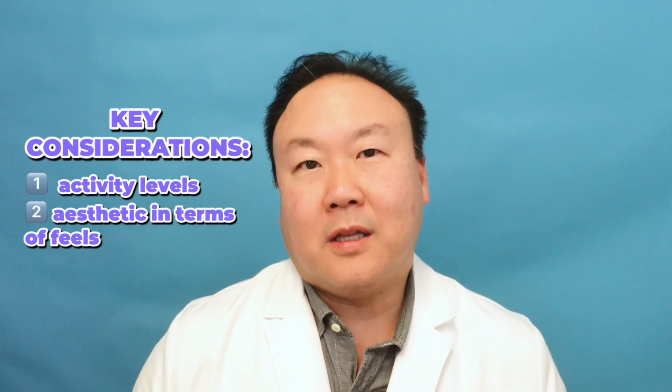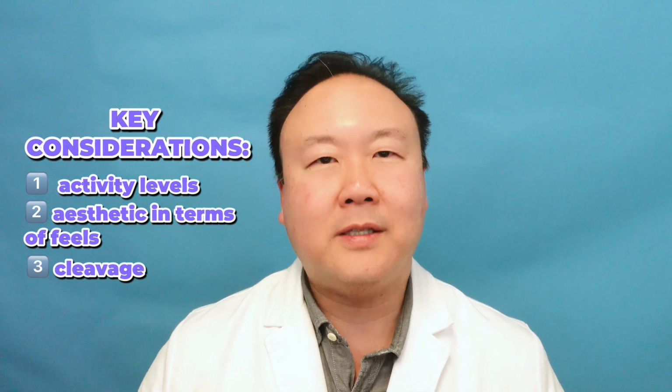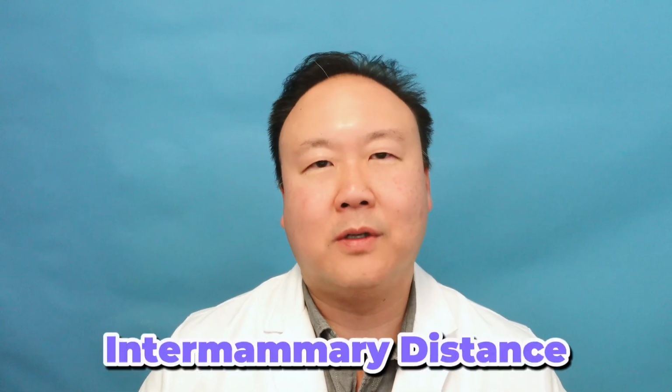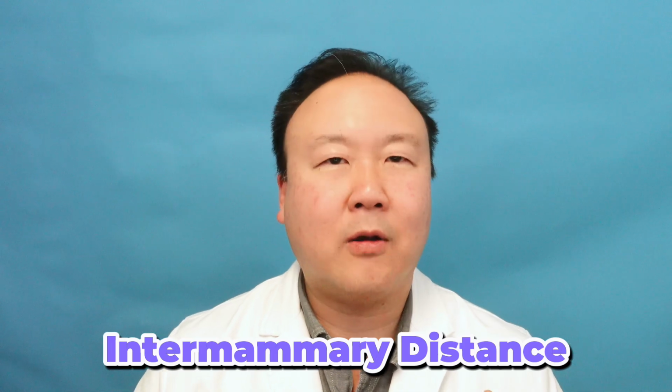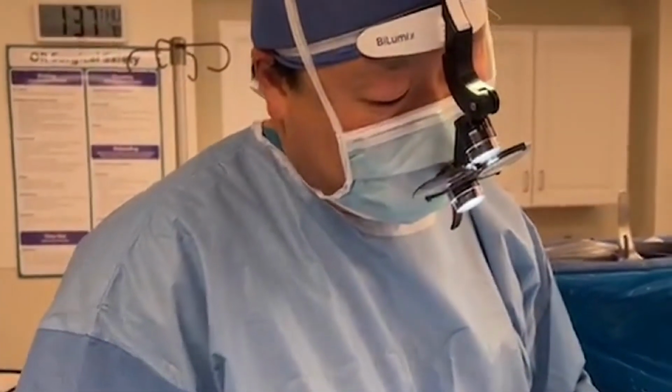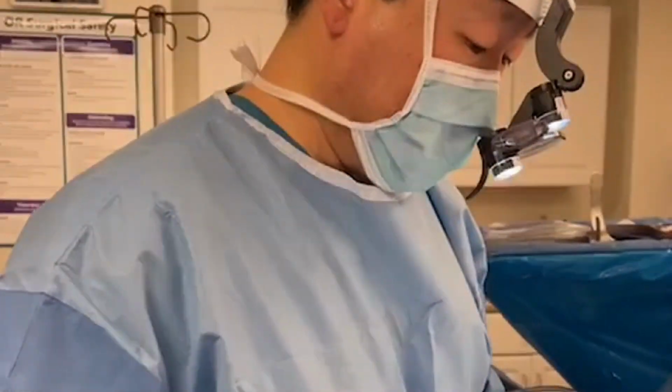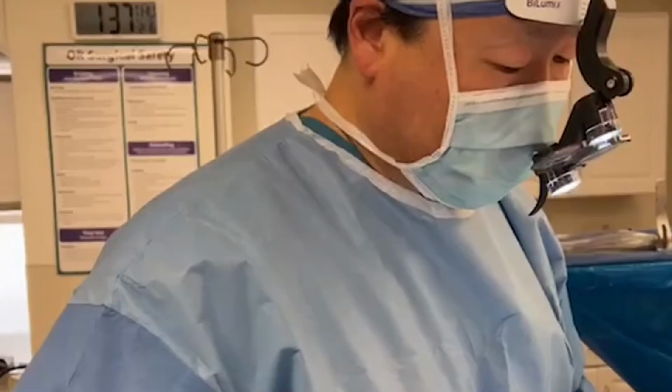Another consideration is cleavage. So I definitely find that placing it not under the muscle, I'm able to actually create better cleavage. In other words, inter-mammary distance, how close the implants are or not. If they're under the muscle, in other words, dual plane, I do create a very precise pocket, but I have to change my technique a little so that you can actually see cleavage long term. That is a consideration, and definitely talk to your plastic surgeon about it.